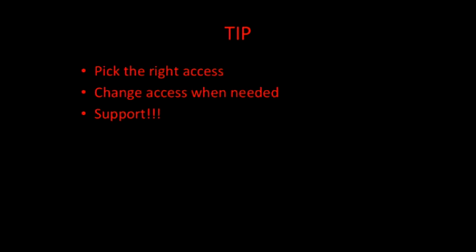And lastly, I'm sure all of you know, you can never have too much support. There's no such thing as too much support. So where required, you take catheter inside a guiding catheter. Through that.